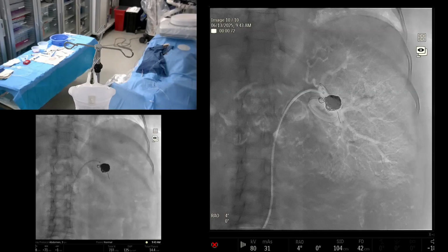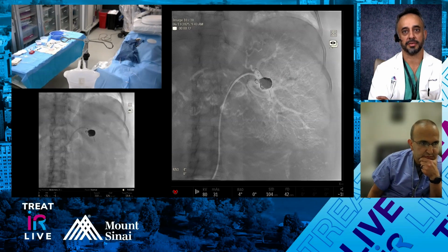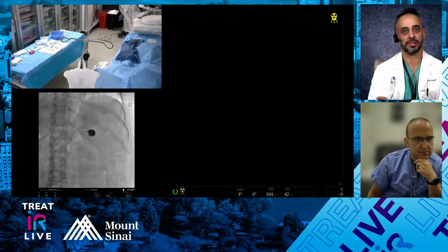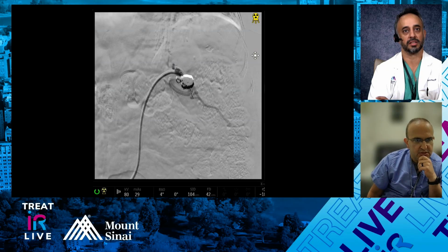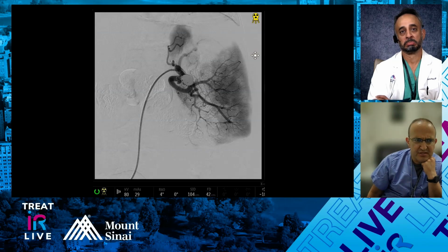So Ed, while you're stepping out to do the run, did you heparinize this patient during the case? Because you obviously have the sheath up around the celiac and splenic artery. No, we did not heparinize. We have a side flush for sure with heparinized saline, but we didn't give any heparin. Rose, do you usually heparinize your patients? No, it depends.